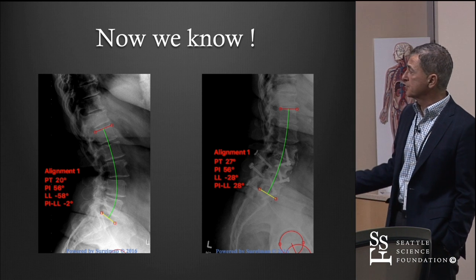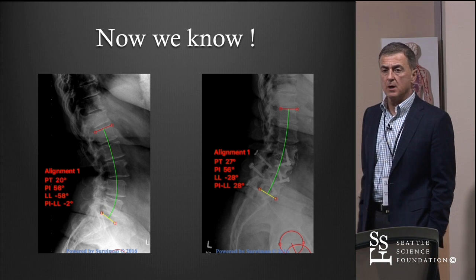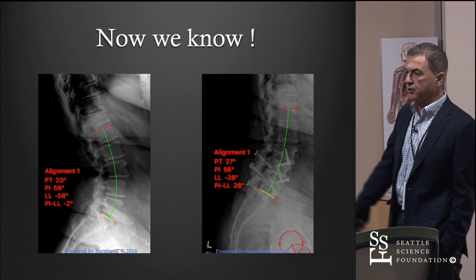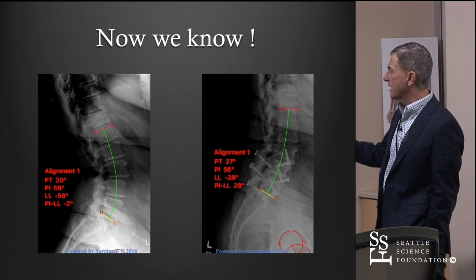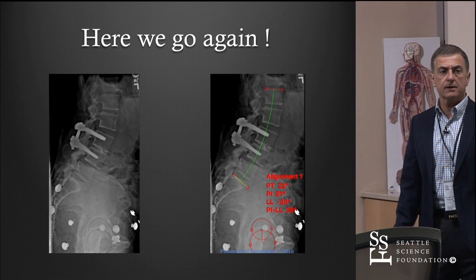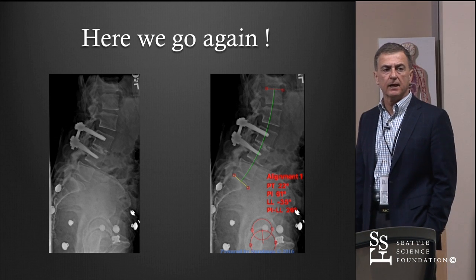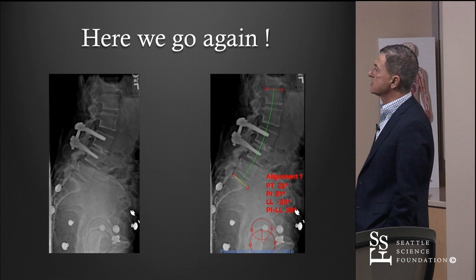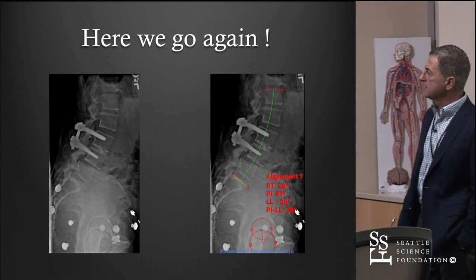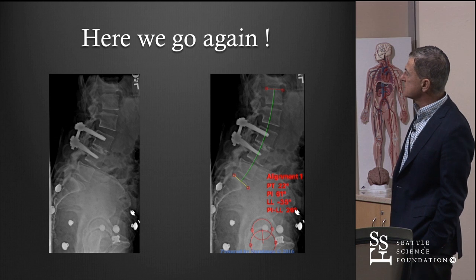So you just converted a L3-4 mild degenerative spondy into a major deformity case. This is where I'll call my friend Jens and I say, hey, Jens, you got to deal with this. I don't know what to do with this. This is an everyday case, right? I mean, this is like a single-level TLIF on a young patient. This patient is a 42-year-old athletic lady, had a TLIF, and then she shows up in my office with this.